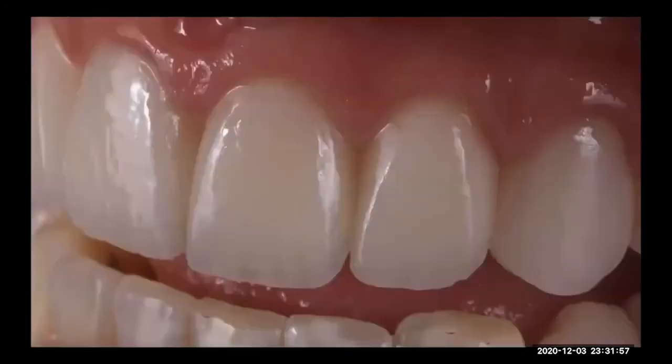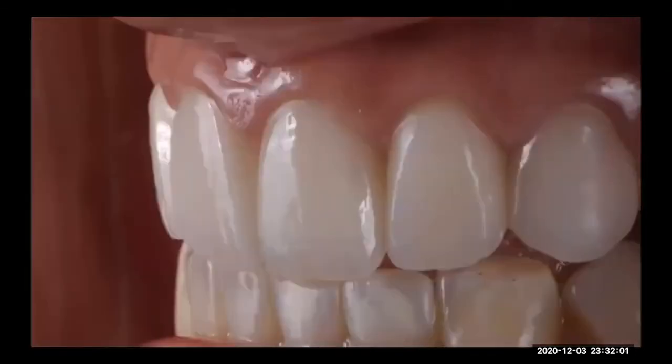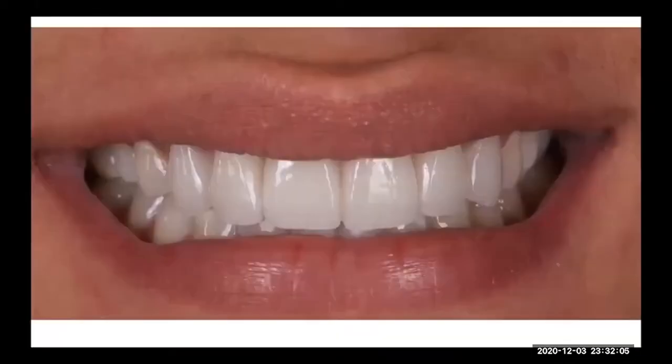So this is the case 6 months later. We can see here the texture, all the anatomy. It's something soft. It's something that breaks the incisal edge and makes everything non-monolithic. It creates the 3D effect.